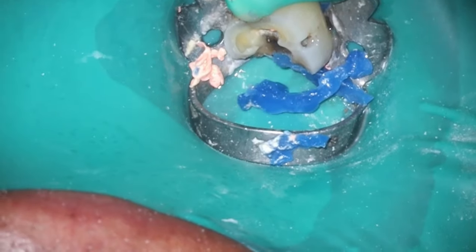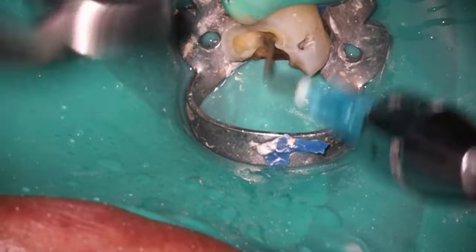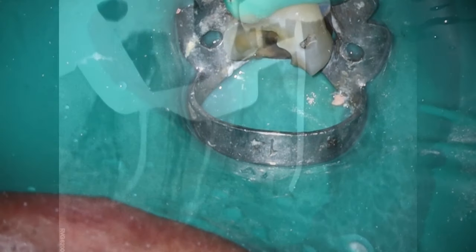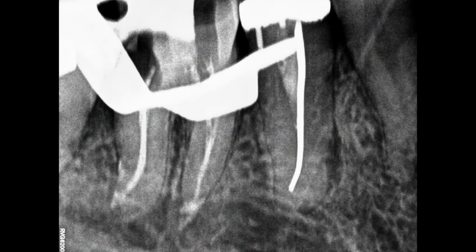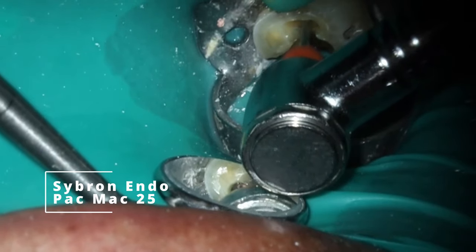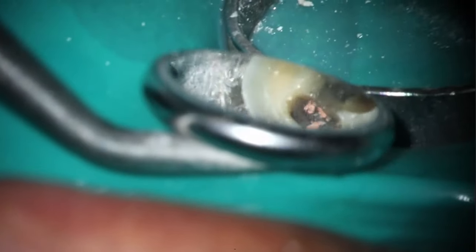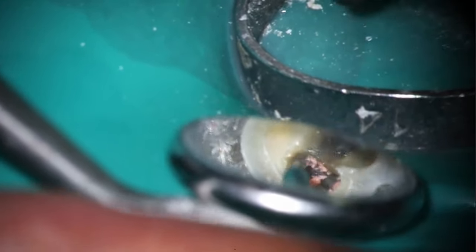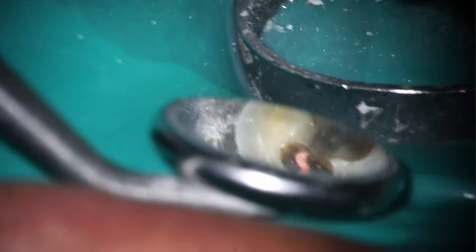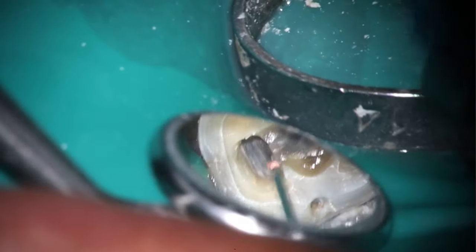Getting the rest of the block-out off with a cotton pellet. You can either use a small non-flexible condenser to pop it off, or in this case I'm just using a wet cotton pellet. The assistant can then suction all those big pieces out, so when you do your restorative you save time and don't have to worry about removing anything extra. At this point there is a void right where the type 2 joins, so we're going to fix that. This is what the Pac-Mac was designed for — going back in gently. You only need to go in maybe six or seven millimeters.